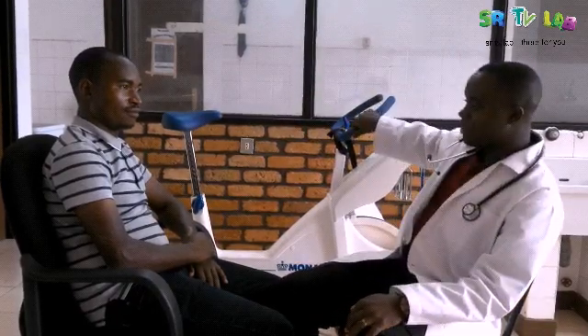First of all, we are going to measure blood pressure while our patient is at rest. And then we are going to put our patient on a stationary bicycle. Then our patient will cycle and we measure the blood pressure to see if there is a difference while doing the exercise.